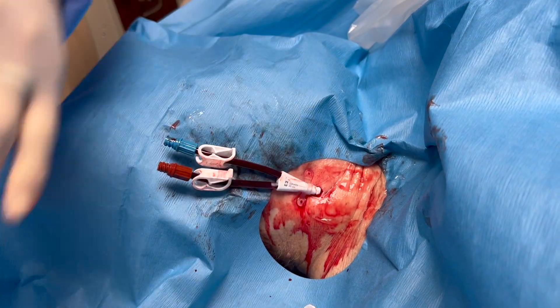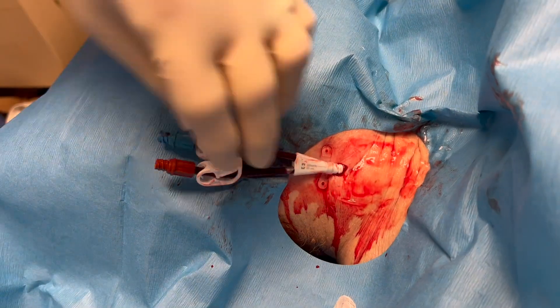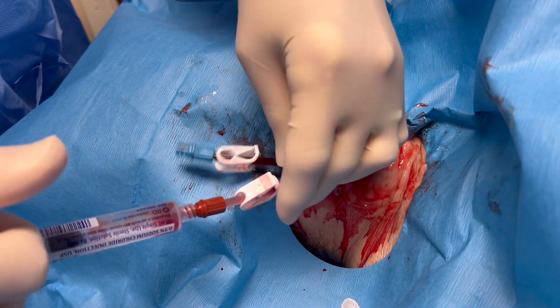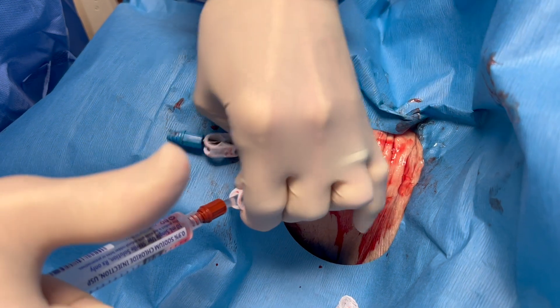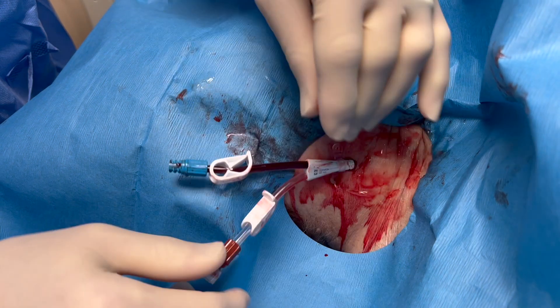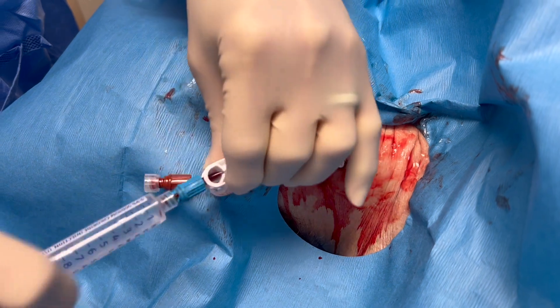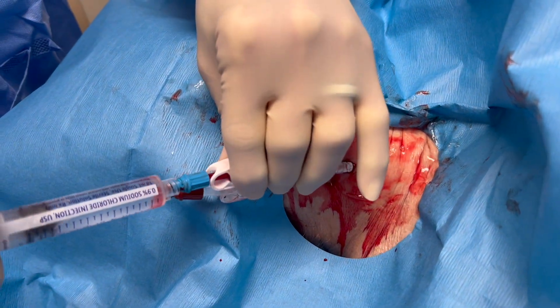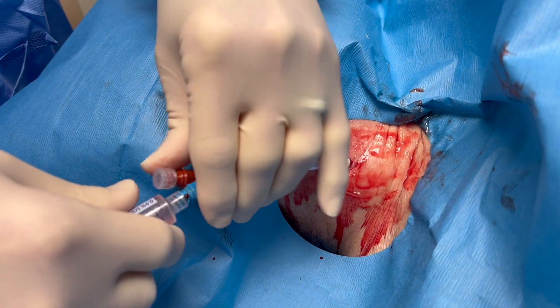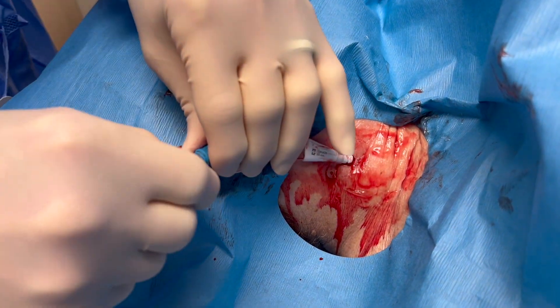Both ports will need to be flushed, and that's generally done with saline. Normal saline flushes used for an IV are adequate for this. Make sure you put a little bit more fluid in — I flush them with a full 10 cc's, or at least 8 cc's. Then there's usually a cap that will go on the end. Depending on your institution, some will want you to flush with a heparin solution — we usually just use normal saline. Flush them with at least 8 cc's, or the whole 10 cc's if you wish, and then cap it.